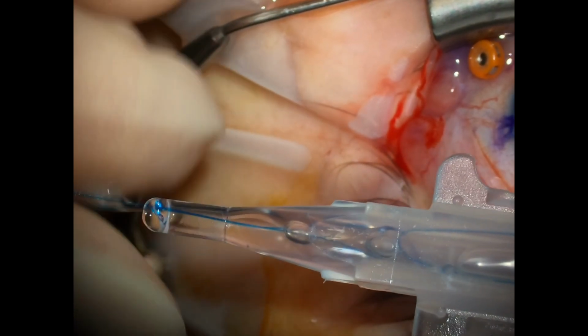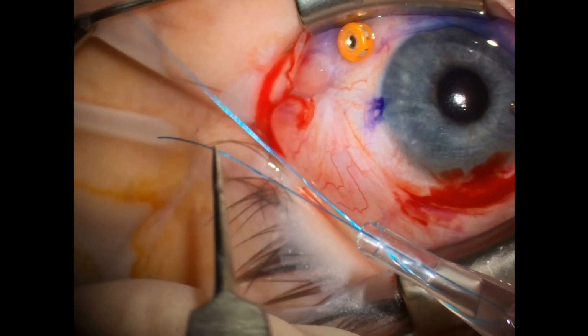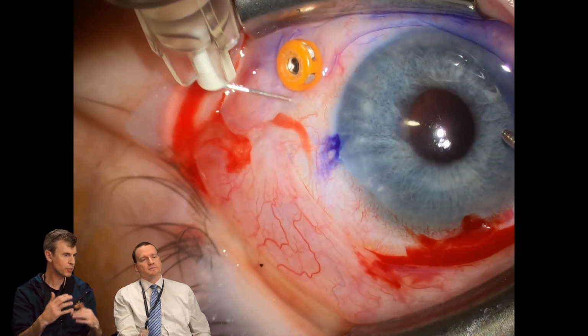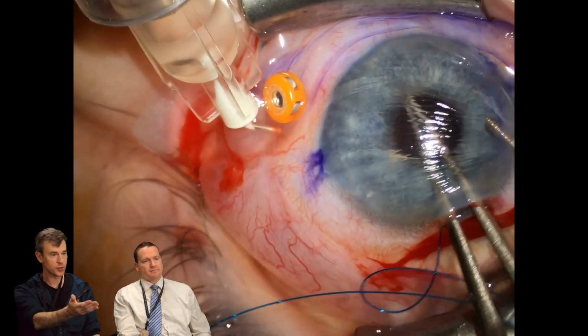The question I have about that placement of the lens: does that require a change to the lens power calculation, because you know it's going to be a little more posterior, a little further back in the eye? So I tend to aim for a -1, which makes them pretty close to no prescription. However, you just see what I'm doing.